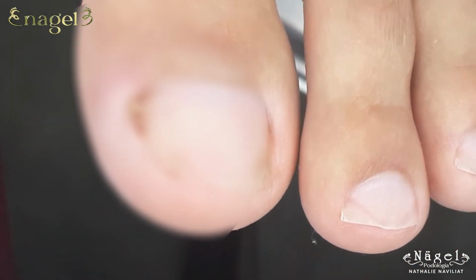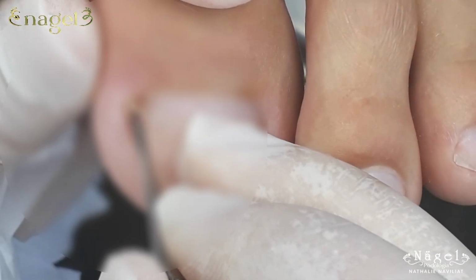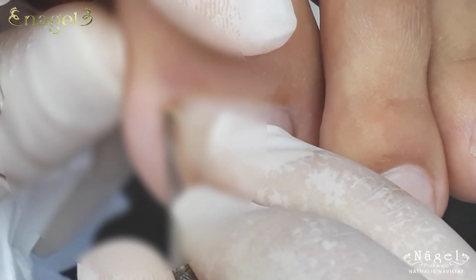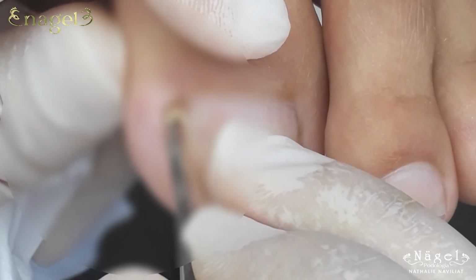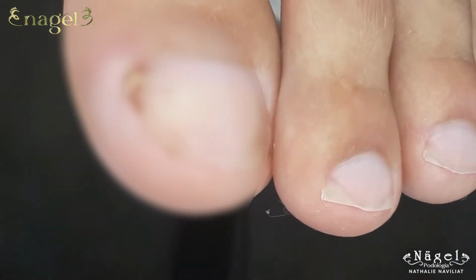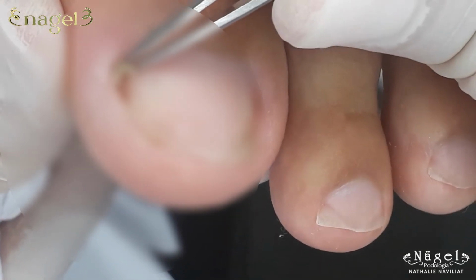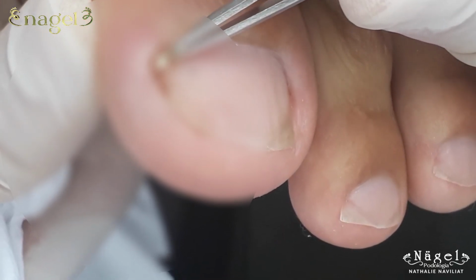Before wrapping up, I note, we'll need to monitor this nail's growth for at least a year, because spurs can come back if we're not careful. I explain that his body might think something's missing and start producing new skin in the area. Sometimes that skin gets so hard it feels like a nail, and we need to clean it up again, I add. I finish the procedure on the left foot with an extra cleaning, apply a light adhesive bandage to protect the area, and check in.